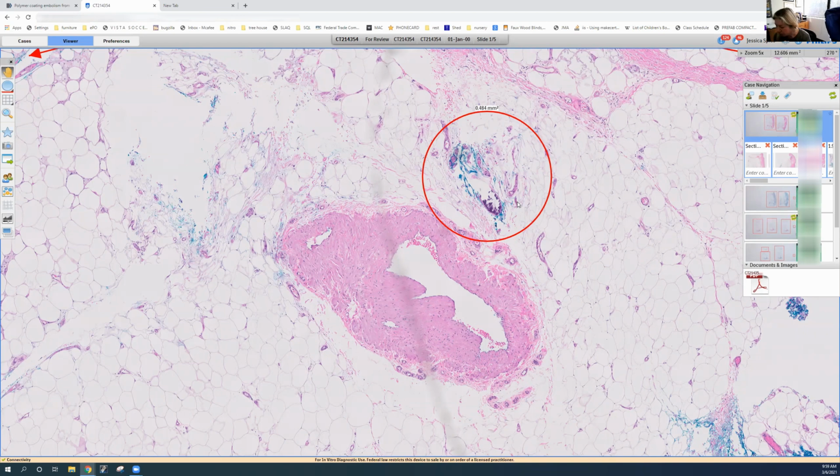The cause of calciphylaxis is not properly understood. We think that the primary event is occlusion of the small blood vessels in the skin and subcutis by thrombus, which results in the spreading ischemia and skin necrosis. But it is thought that the clots occur because of the calcification. It occurs mainly in patients with end-stage renal disease who have secondary hyperparathyroidism, resulting in increased blood calcium levels, although it can also occur in patients with normal kidney function in the presence of hypercoagulability states.